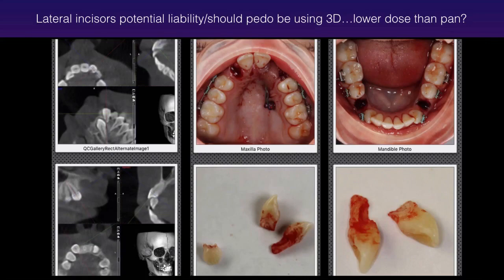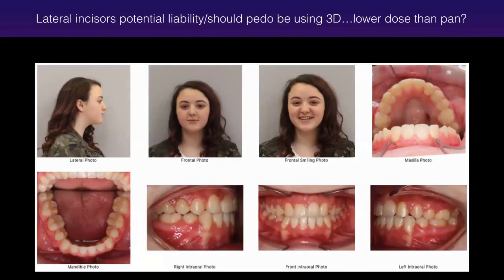Well, you know what? I didn't have to over-radiate my patient with additional PAs that are more radiation than most CBCTs are. I was able to make those treatment decisions with the patient with just the ultralow-dose image that I had. And so this is how she finished up.